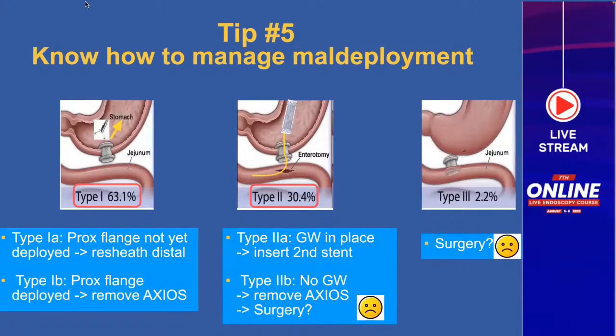Tip number five — the most important: know how to manage maldeployment. Anticipate what might go wrong and have strategies ready to implement. We differentiate three types: most maldeployments are type one (two-thirds of cases), another third are type two, and very rarely type three. I differentiate type 1A and 1B. With 1A, the proximal flange has not yet been deployed, so you can resheathe that distal flange. With 1B, the proximal flange has already been deployed, so you must remove the entire Axios, close the hole, and can start over again.